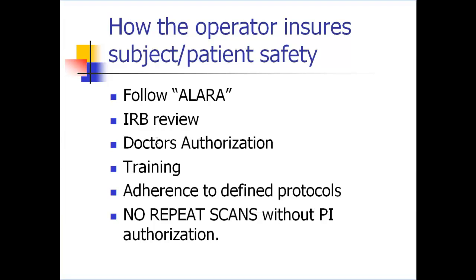DXA scans. If the IRB has reviewed the protocol for a particular research project, then there is the assumption that a doctor's authorization has already been obtained. Otherwise, it wouldn't have passed IRB review, and IRB stands for Institutional Review Board. And the way that we determine whether or not the IRB has reviewed and approved the procedure is through an informed consent document. It would be a blank informed consent document that has a start date and an end date that the IRB has reviewed the protocol for.